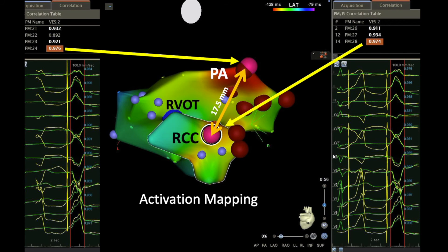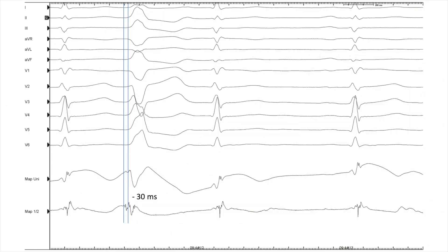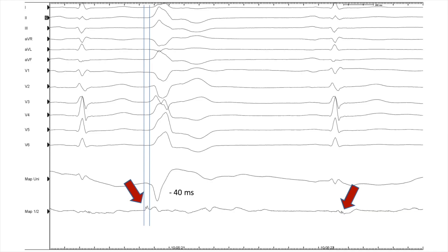This shows the limitations of the pacemap in exact localization of PVCs from outflow tract. Here we see the best signal in the right coronary cusp with transient successful ablation, and here we see the successful ablation site. During sinus rhythm, the local potential is late, and during the PVC, this local potential is almost minus 40 milliseconds earlier than the beginning of the QRS. This is an interesting example of PA potential, which corresponds to cusp potential in patients with LVOT-PVC.